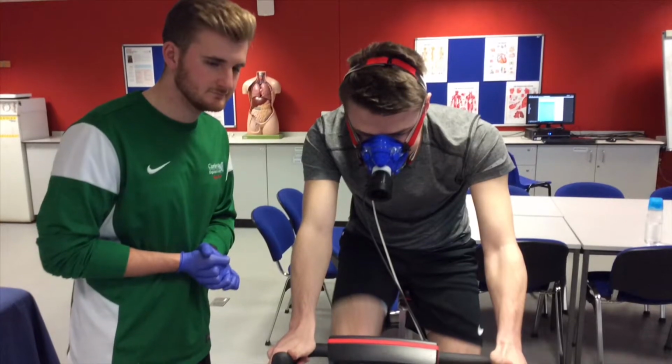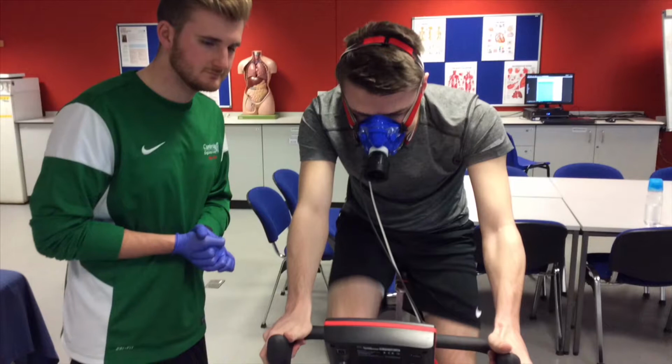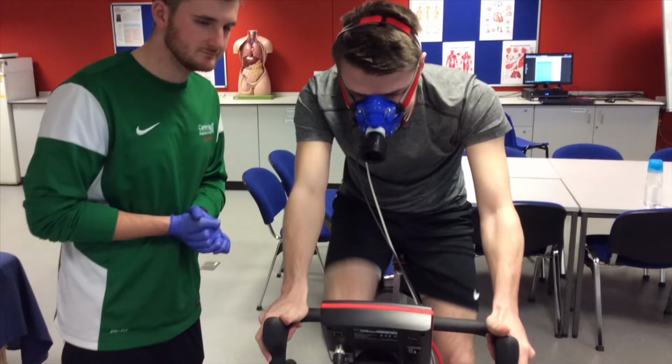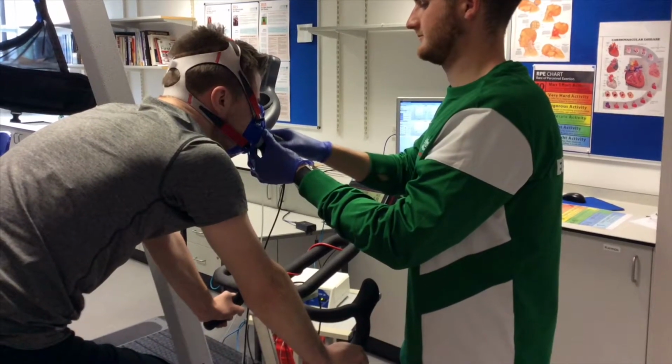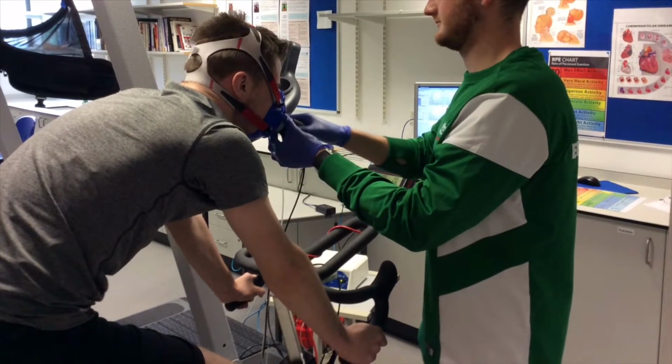Here is the client participating in the VO2 max test on the bike. VO2 max testing on the bicycle is described as a benchmark to gauge endurance of an individual. Coltman, 2017. The client has finished the VO2 max test, so the VO2 mask is being removed safely. It is then sterilised to remove all germs and bacteria that may be present.